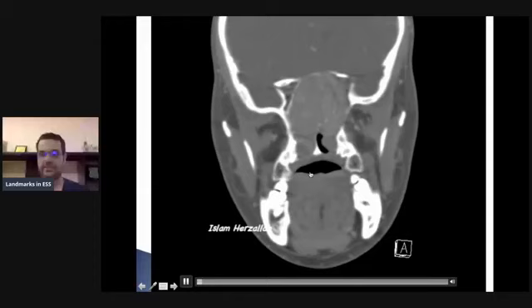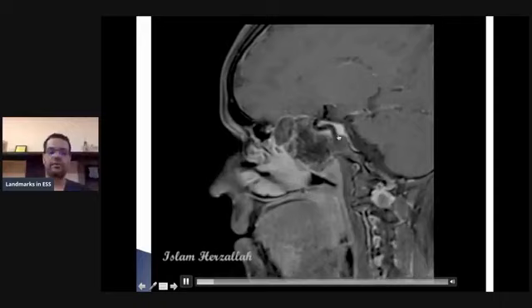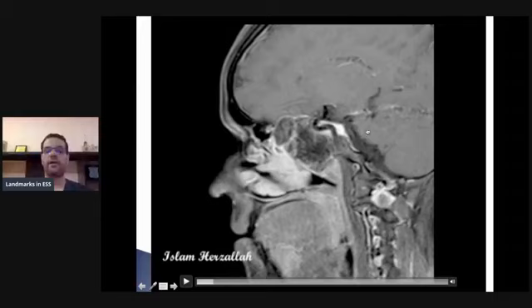In this example, I'm using intraoperative navigation as well. An MRI was also done for the patient; let me show you the MRI. You see the internal carotid artery. The MRI shows the internal carotid artery not in the middle of the field, but at the margin, where you will touch it. I'm going to show you the intraoperative scenario right now. You see the internal carotid artery right here.